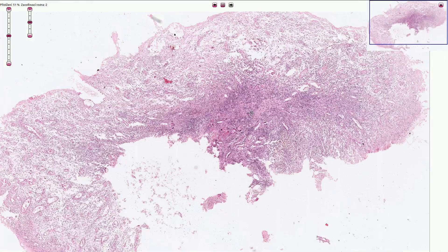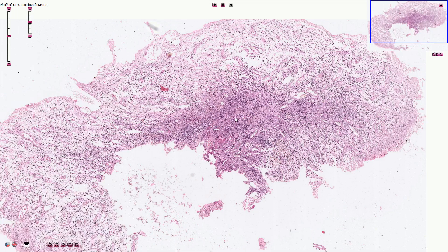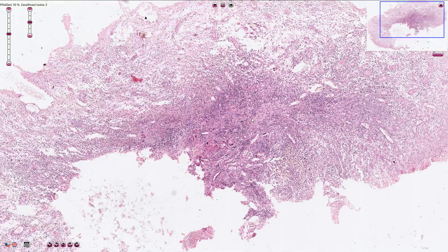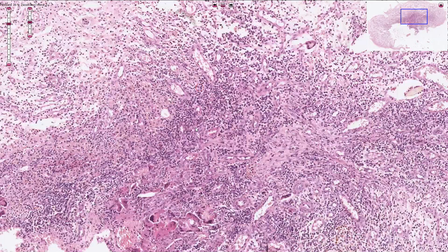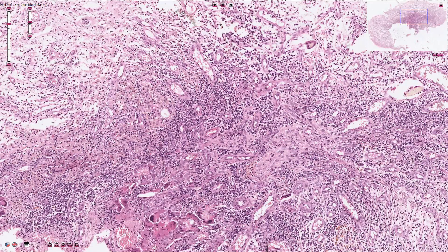Granulation tissue consists of fibroblasts, myofibroblasts, inflammatory cells, and capillaries. A few capillaries can be seen here — they are lined with endothelial cells and filled with erythrocytes. Additional capillaries are visible here, here, and here.